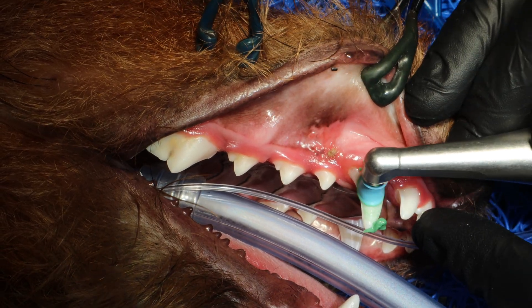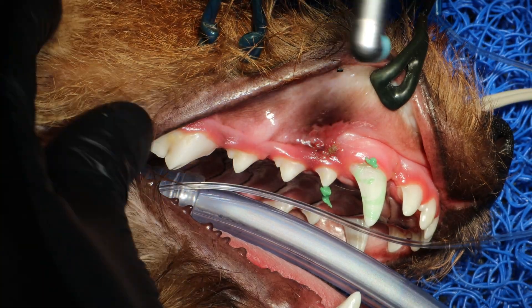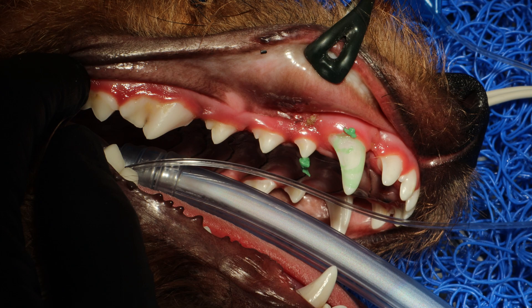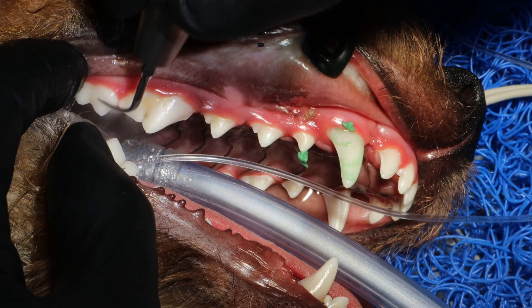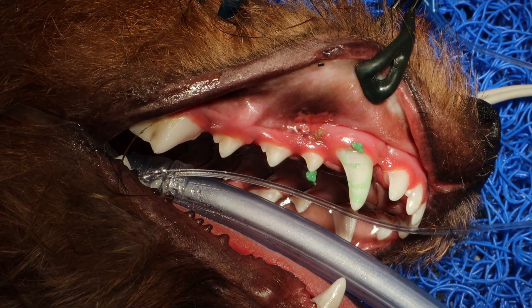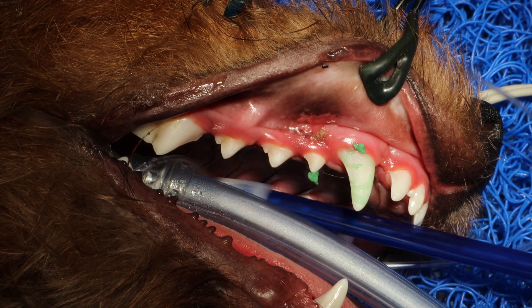The first thing you do when doing these corrections is that you clean and polish the surface. If you see some calculus, make sure that you clean that off with the ultrasonic scaler. It's best to use a fluoride-free pumice so you don't interfere with the bonding process.